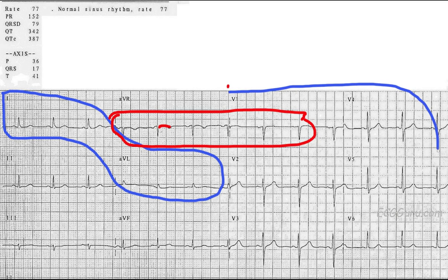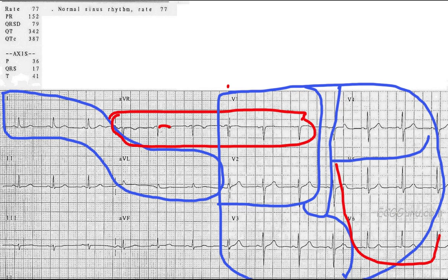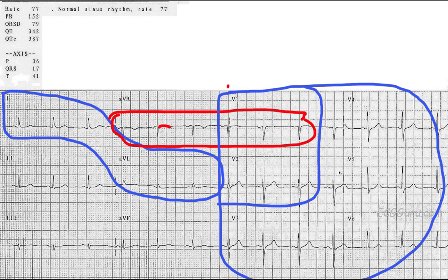The anterior wall is represented by all the leads on the right of the paper. It's such a large area that we break it down into segments: V1 and V2 show us the septal area of the anterior wall. Screen them for ST changes. Then look at V3 and V4 together and screen for ST changes. Then look at V5 and V6 together and check for ST changes. If we find ST elevation, we would possibly be looking at a diagnosis of an anterior wall MI.